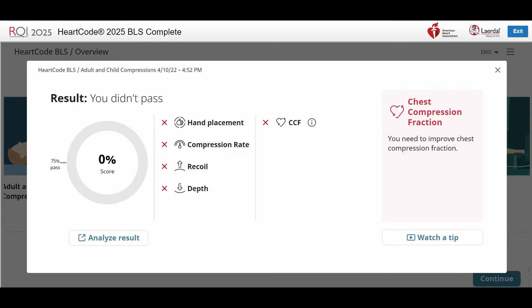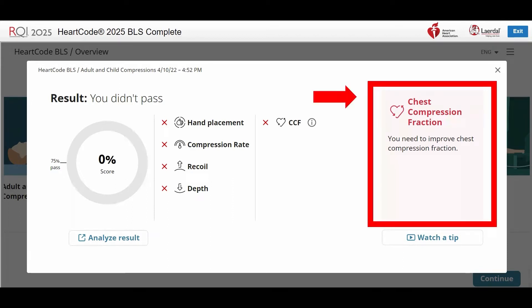Unsuccessful feedback metrics. On the left, the percentage score is 0. A red X by the metric confirms that you did not successfully meet the objective. If you have a score from 0 to 99%, the box on the right will be red and display the metric that essentially caused you to lose the most points. This is the most effective metric to work on first.